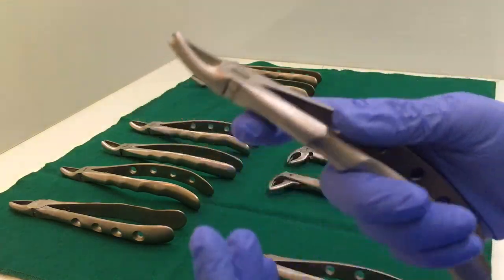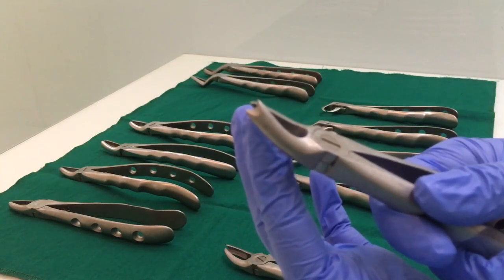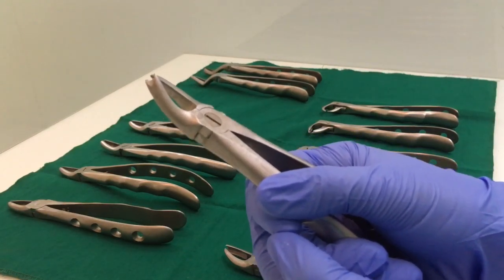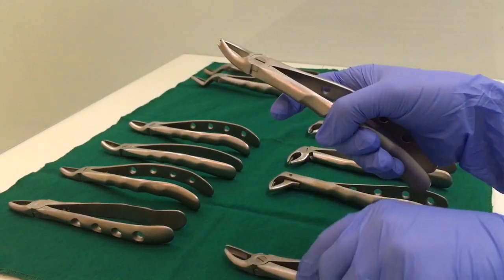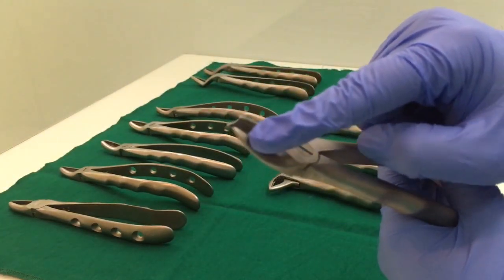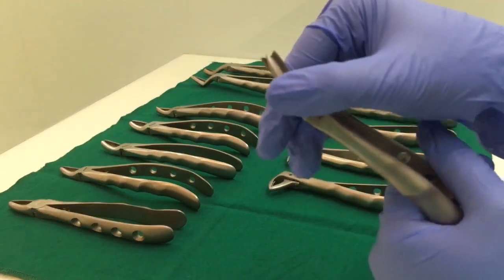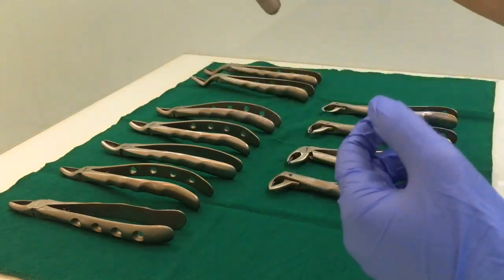If you hold it like this, the pointed one should come buccally and the bifid beak should come on the palatal side. So this forcep, if you hold it like this, becomes your left side — this is your left upper cowhorn forcep. Similarly, this is the pointed beak which will come on the buccal side, and the bifid one will come on the palatal side to hold the palatal root. So if you hold it like this, this becomes the right side. This is how you identify them.